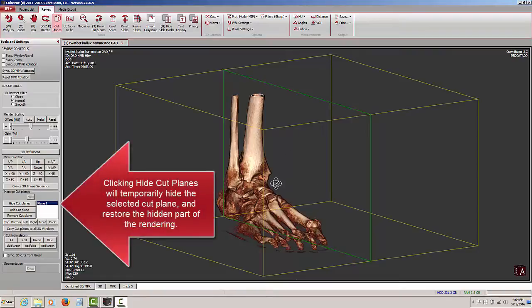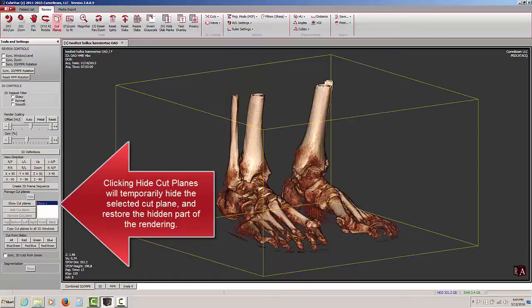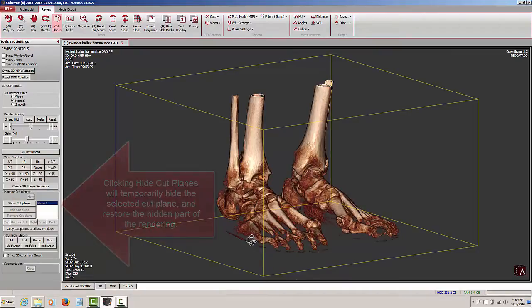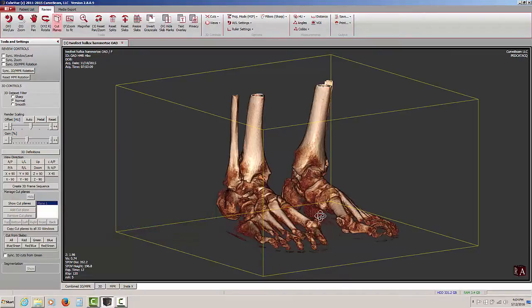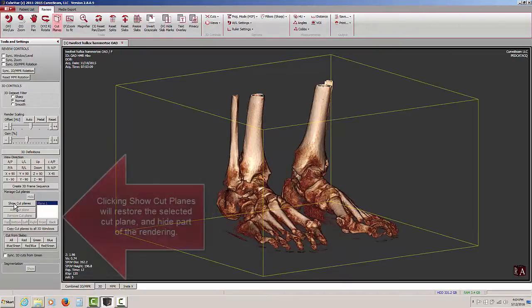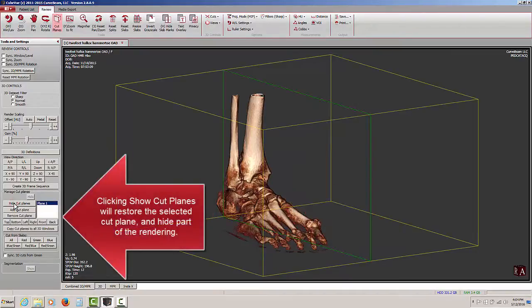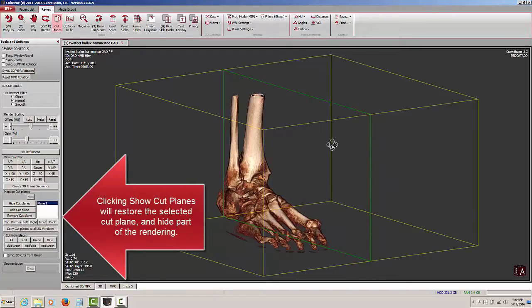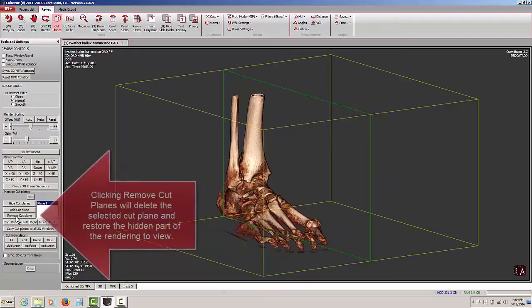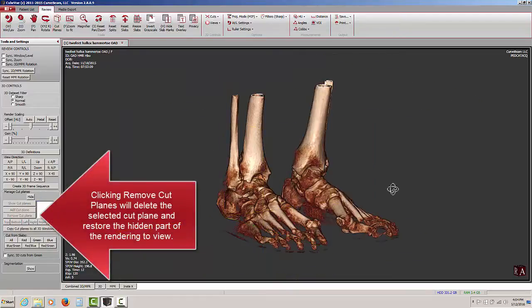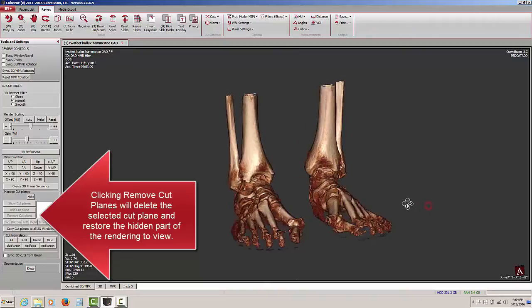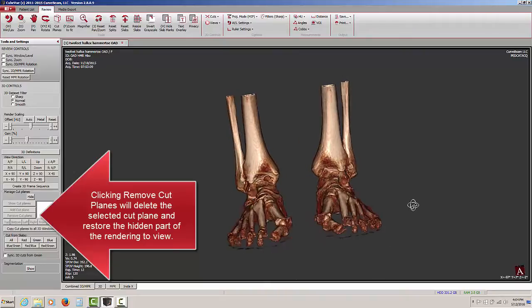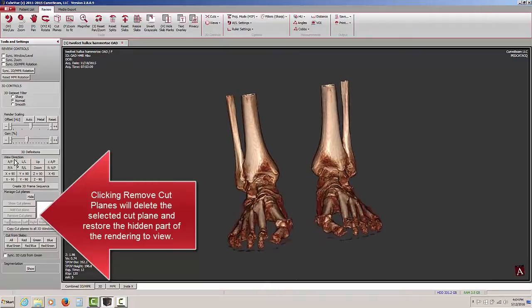If at any time we want to revert back to the full data set and bring it all back into view, we can click on Hide Cut Planes. In this case, the green outline of the cut plane is no longer visible, and both feet are. Clicking Show Cut Planes again restores the cut plane and removes from view the part of the data set that has been selected. We can also remove the cut plane in its entirety, and then we're back to our full data set again.